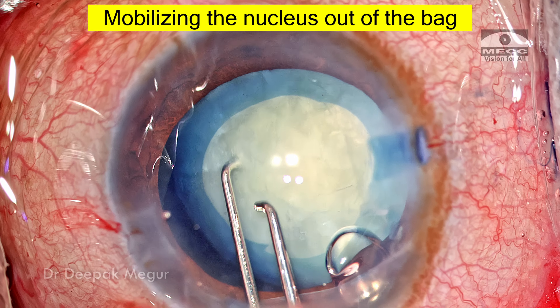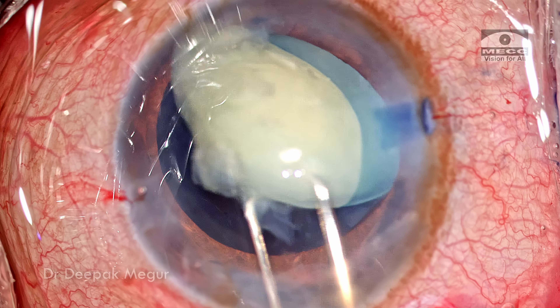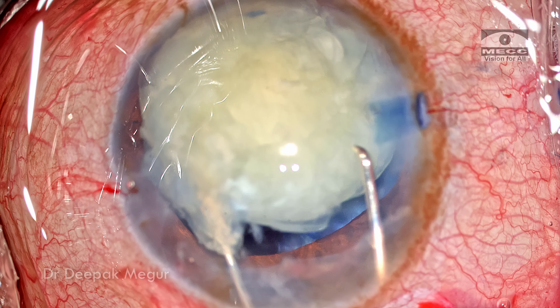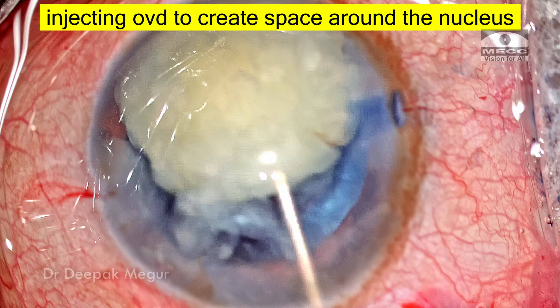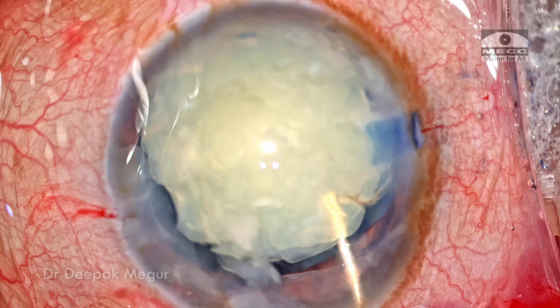Using two Sinskey hooks, the nucleus is mobilized out of the capsule bag into the anterior chamber. OVD is placed around the nucleus to create some space both beneath and above it. Now is the time to introduce the snare.